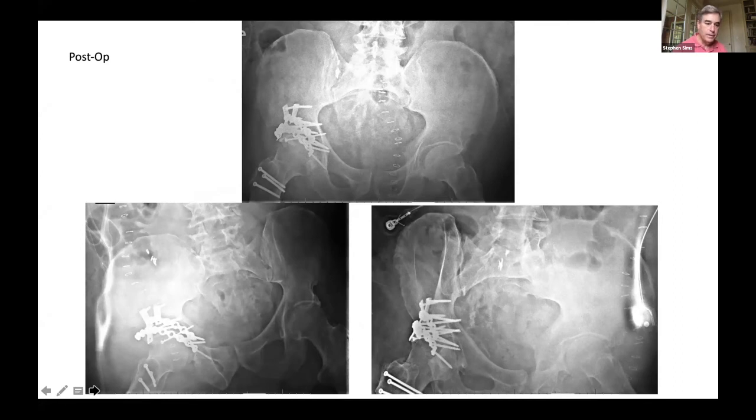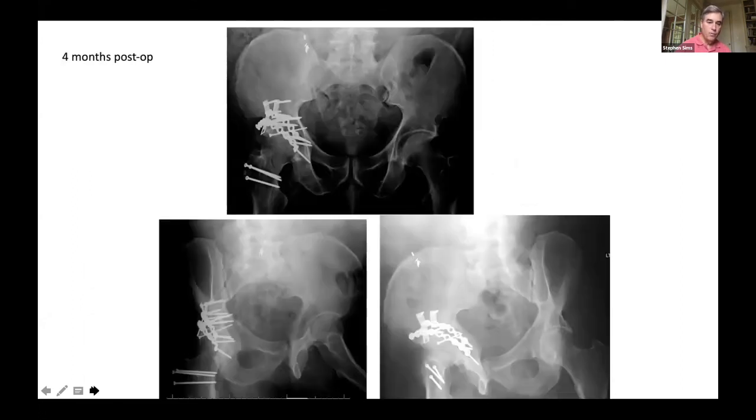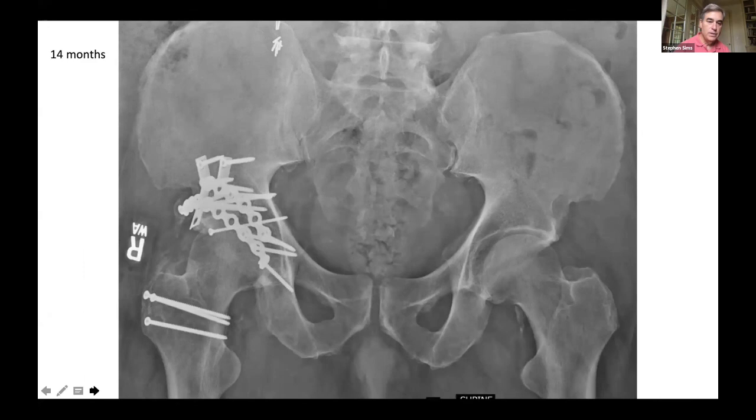These are his post-op x-rays, and I'll apologize because I think they're really ugly x-rays, because there's so much metal that it overbears everything, but I'll show you the post-op films. This was him coming back at 4 months. He's still maintained. He's one of those guys, every time he comes to clinic, I hold my breath and hope that he's not dislocated again. And this is him at 14 months out. This was the last x-rays I have of him. You can see his hip is not normal, but the hip remains congruently reduced, and he's actually got fairly good function.